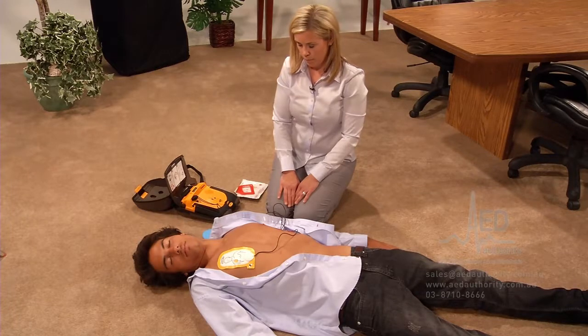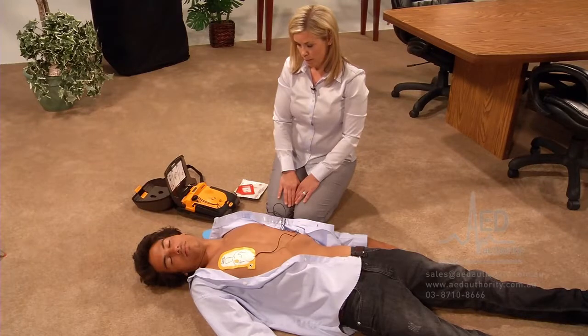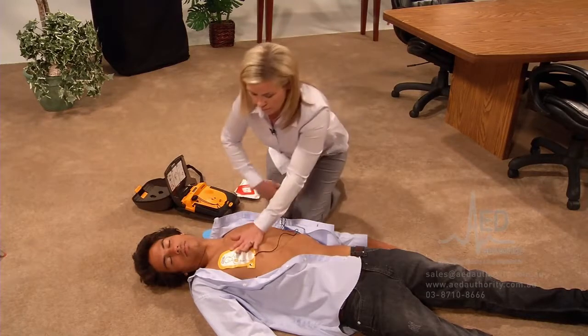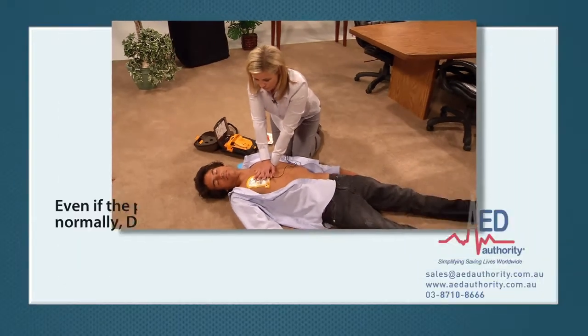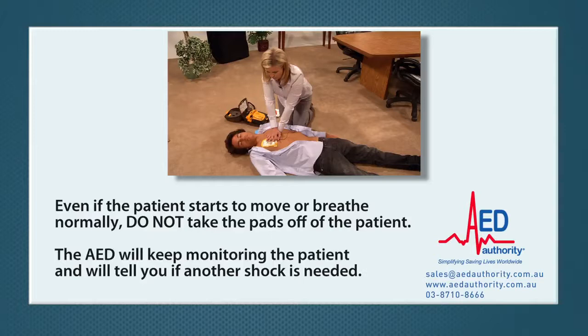It may decide to shock again, or it may say: "No shock advised. Provide chest compressions and rescue breaths." Even if the patient starts to move or breathe normally, do not take the pads off. The AED will keep monitoring the patient and will tell you if another shock is needed.